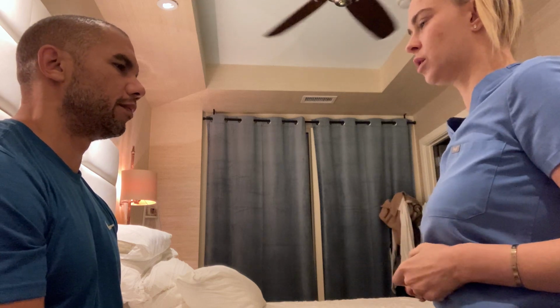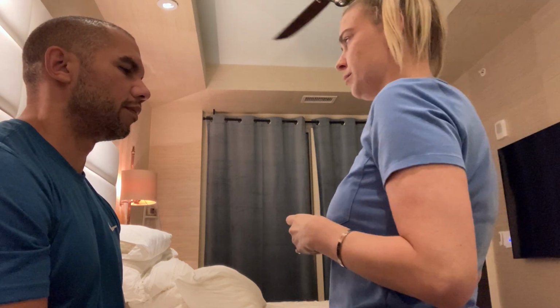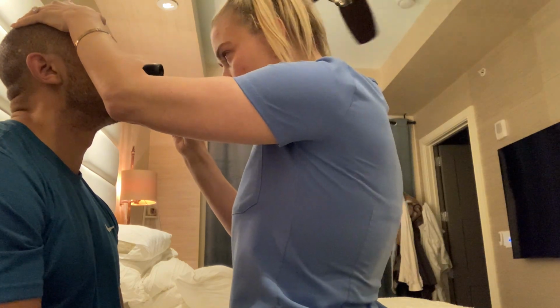Have you had any changes in smell, any lesions, drainage, dryness, difficulty breathing? No. Okay, I will go ahead and inspect your external structures first. It looks symmetrical, no lesions, no deformity, no bumps, nose is midline. Okay, I will inspect your nares with my otoscope. So if you look up for me for a second.